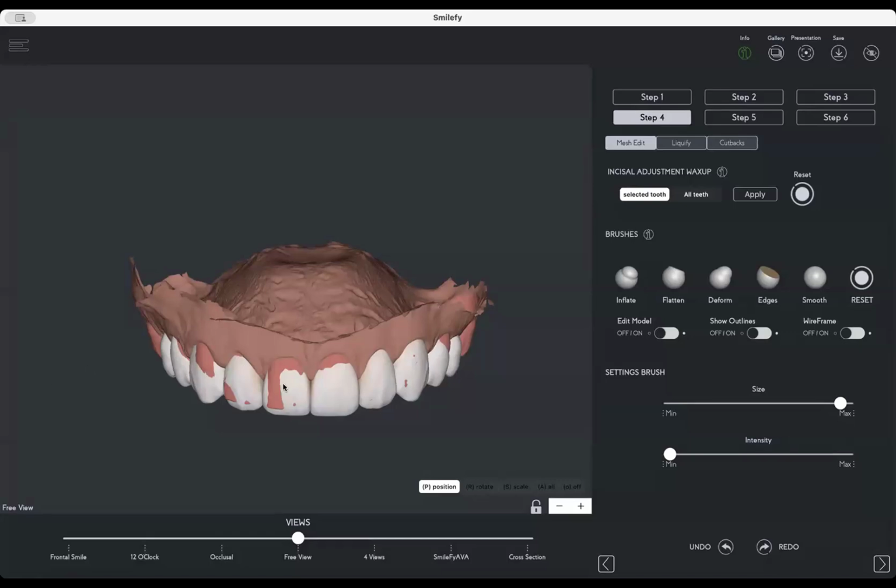You need to prep this area, and you will prep this area based on the material that you need to use for your restorations. So if you go with zirconia, you need to prep 0.4 because you need to mill. If you go with composite veneers, you can use a smaller bur and prep less, because composite can be done very, very thin, depending on what you do.